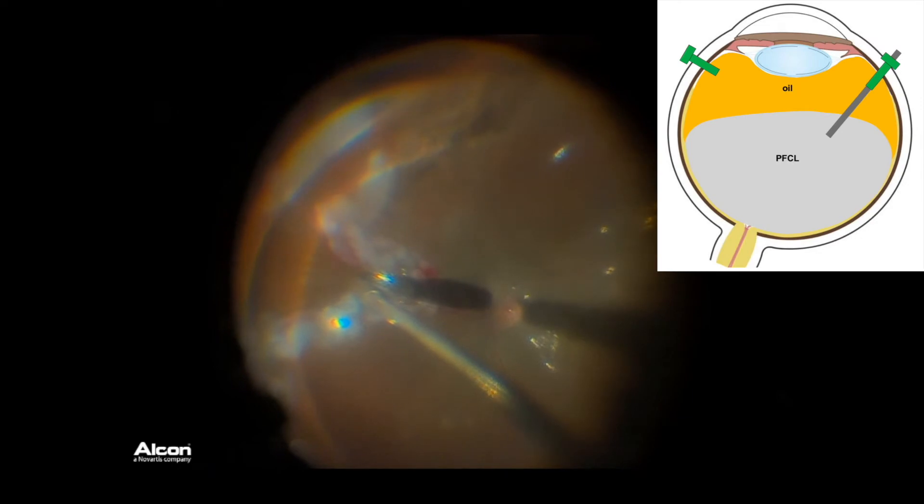After removing the BSS layer, PFCL is aspirated as the silicon oil is injected in the eye, as shown here, mainly at the edge of the retinal tear.